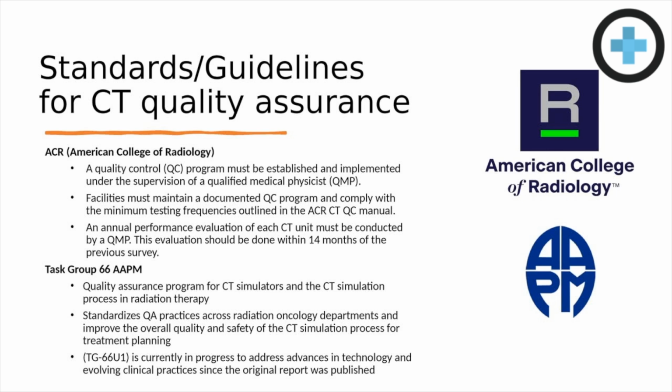In the States, there are two that people look at the most. ACR is always a driving force in the U.S., and a lot of other countries look at it as a good benchmark. Also, we'll look briefly here at Task Group 66 from AAPM. They also have some recommendations, but for ACR, a quality control program has to be established and implemented under the supervision of a qualified medical physicist, and facilities have to maintain documents and QC programs and comply with minimum testing, whether it's daily, monthly, yearly, or the annual notifications.